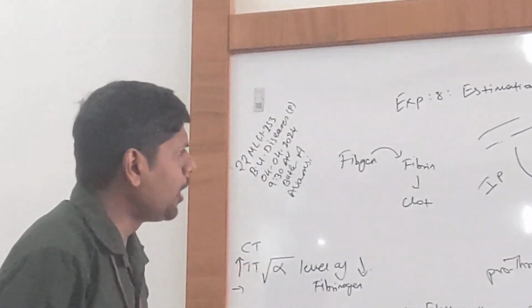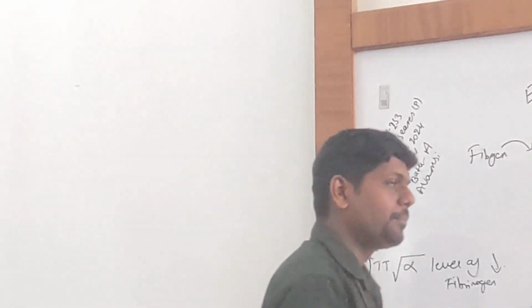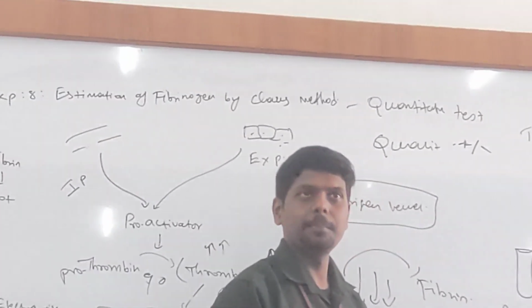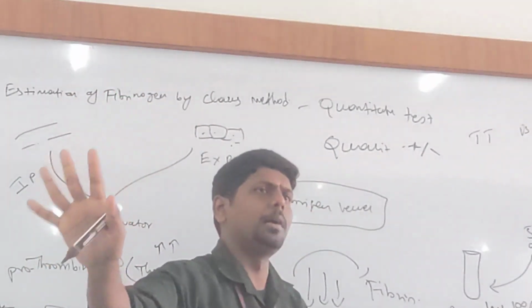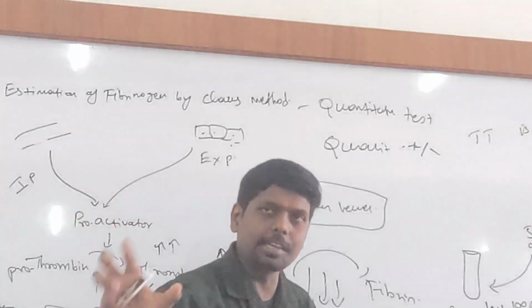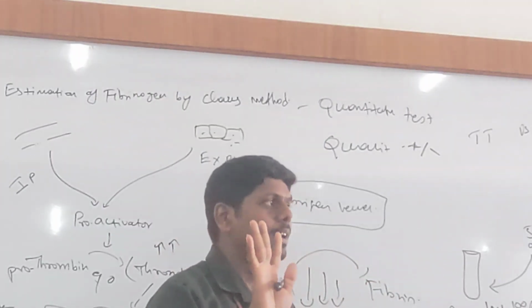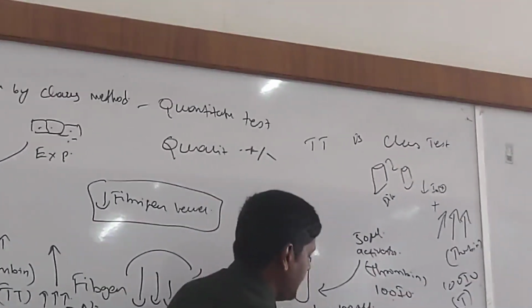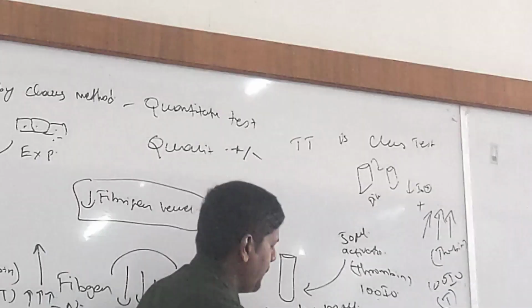And now, can you think in this way? I got a patient with a DIC. I know that my patient got a DIC. He got multi-clotting. He got an ischemic heart attack. He came to my lab. Now what the doctor did was, the doctor kept the patient under warfarin therapy, or he kept him under heparin therapy.